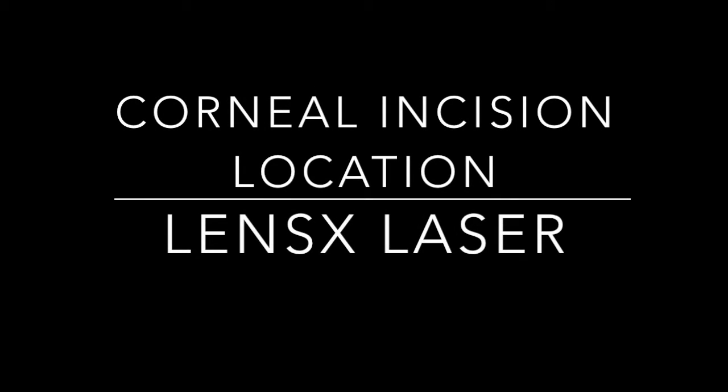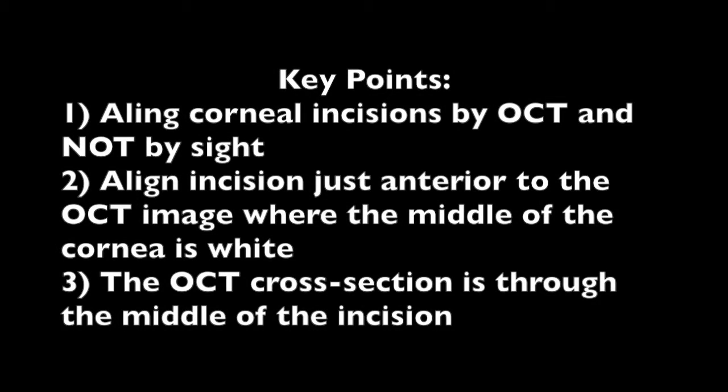I'd like to go over corneal incision locations with a LenSx laser. I think there are three key points to aligning the corneal incision up at the limbus.